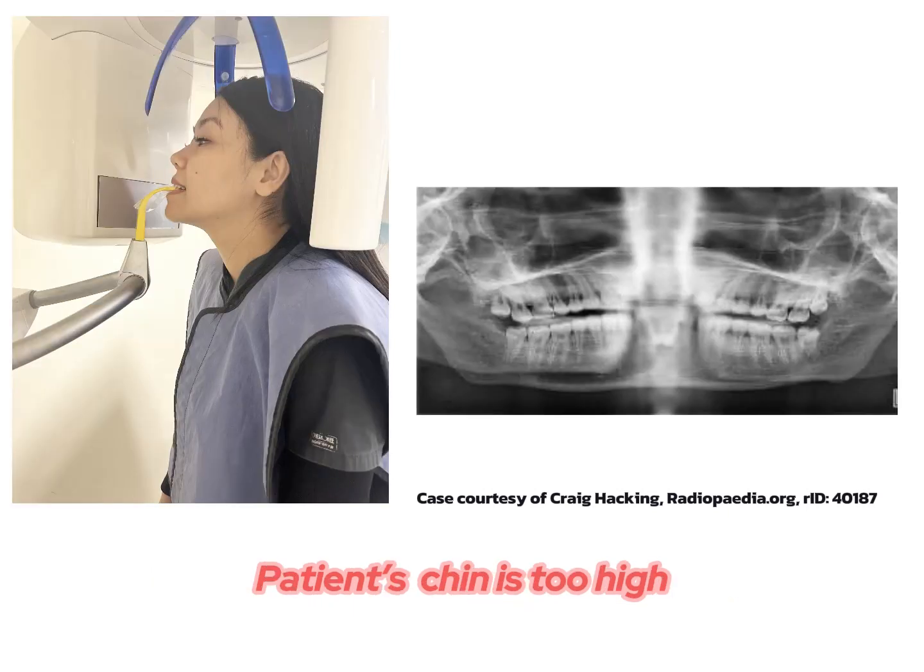floor. Chin is too high, Frankfurt plane upward, reverse smile line. The condyles may not be visible or may appear near the lateral edge of the image. A loss of detail occurs in the maxillary incisor regions. To correct this, the clinician must carefully position the patient such that the Frankfurt plane is parallel to the floor. The plane must pass from the bottom of the eye socket through the top of the ear canal.